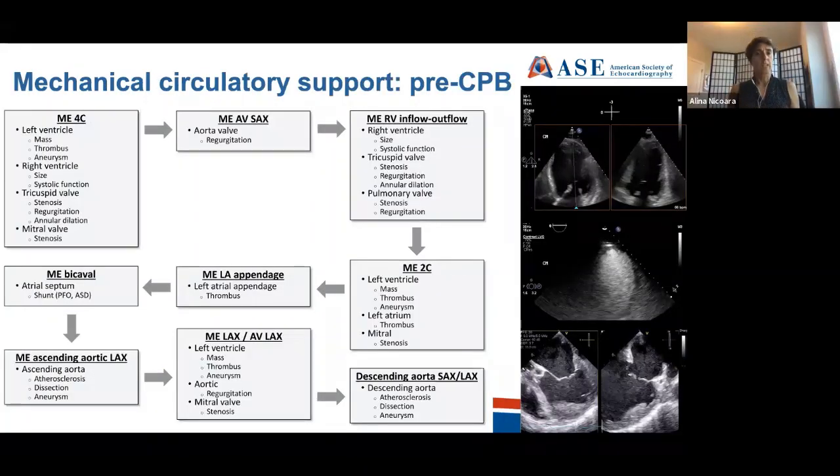Going over to mechanical circulatory support, this is a proposed imaging strategy for patients who undergo placement of a durable left ventricular assist device. It's a sequence of views which makes more sense in terms of level of imaging and angle of the omniplane, but obviously the imaging can be done in any sequencing desired. However, all these elements of the exam should be evaluated, particularly things that may change the surgical plan.